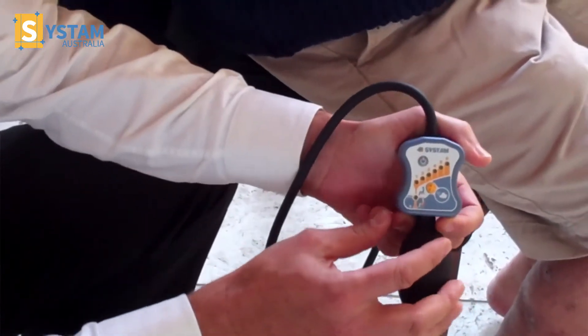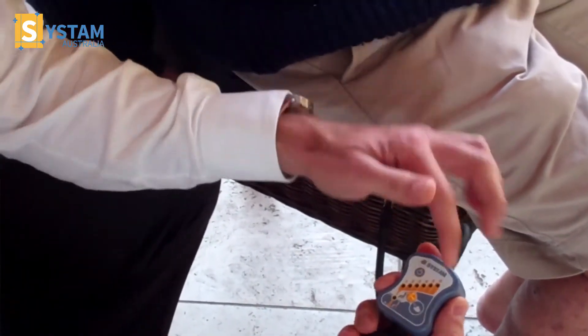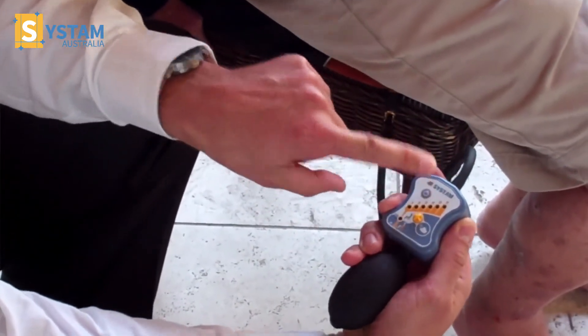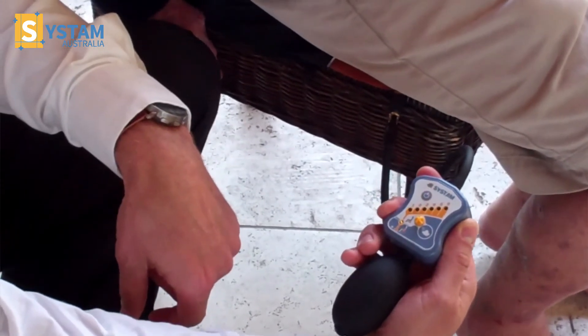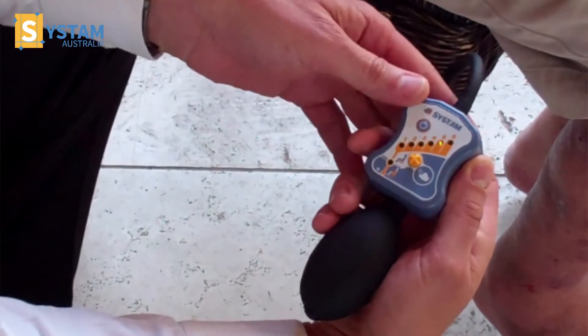This is the pump. You can see it sits in the hand comfortably — it's ergonomic. My thumb can just sit on one side. I turn it on up here, just click it once and it'll calibrate and then it'll settle on a number.